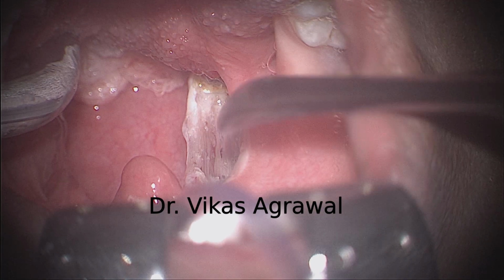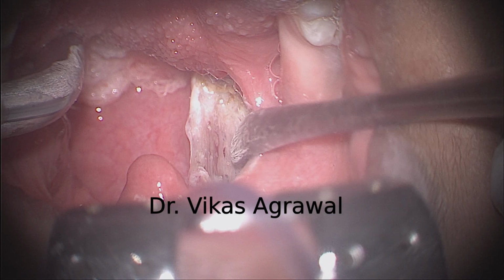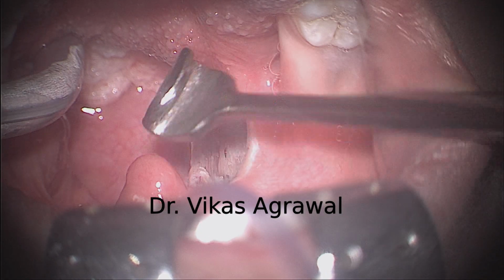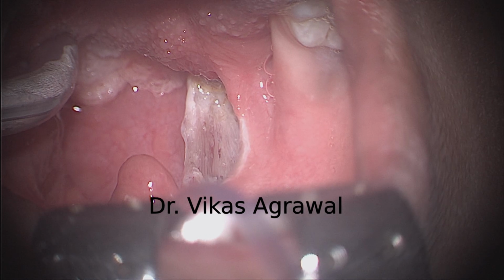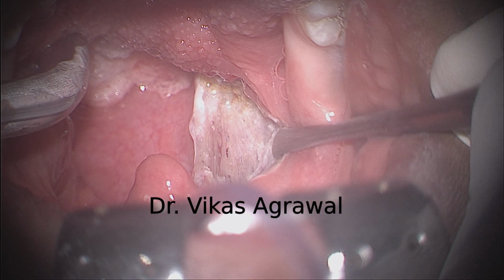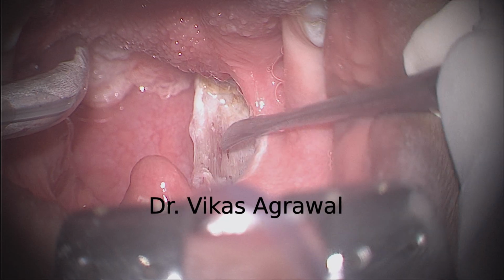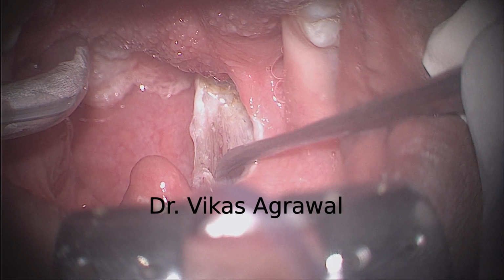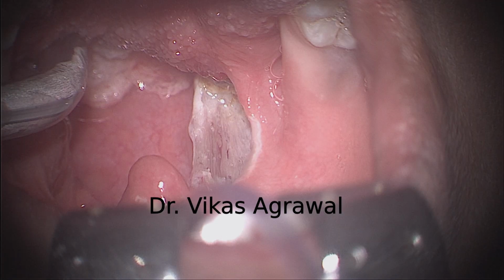As I said, it's impossible to completely avoid the exposure of the muscles, but the majority of the tonsil fossa is covered with the fascia. So whatever part is covered with the fascia like this will be totally painless. Wherever the tonsil was closely attached and you have exposed the muscle fiber, there will be a little bit of inflammation, a little bit of pain here, but that will be minimal.